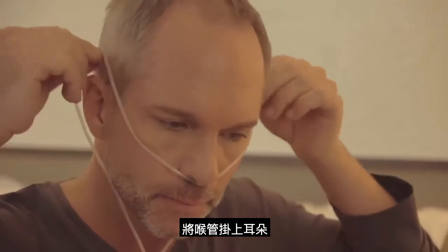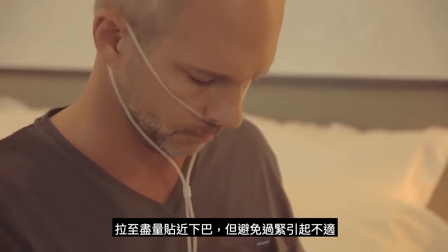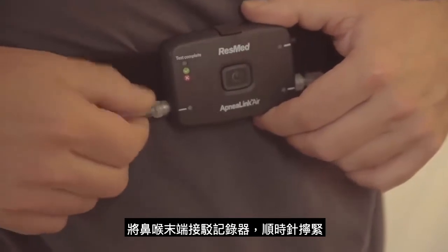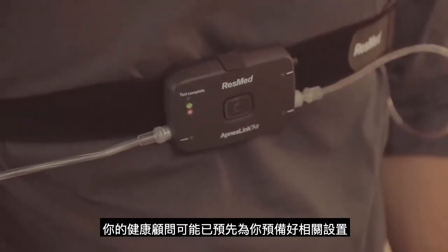Loop the tubing over each ear and tighten the toggle under the chin. Make it snug, but not so tight that it's uncomfortable. Insert the end of the nasal cannula into the recorder, turning it clockwise. Your health care provider may have already done this for you.